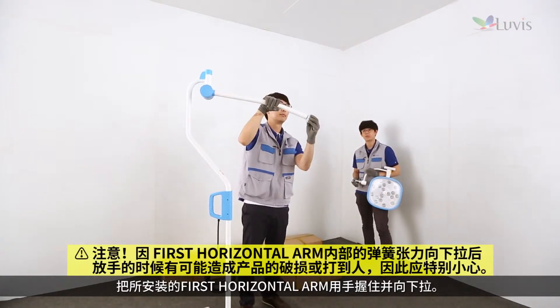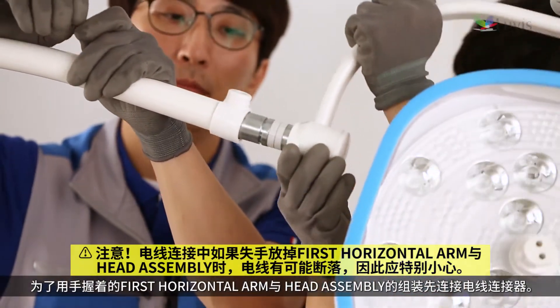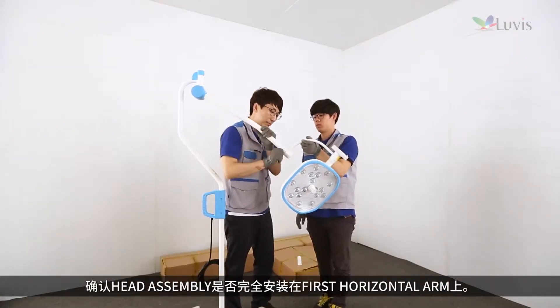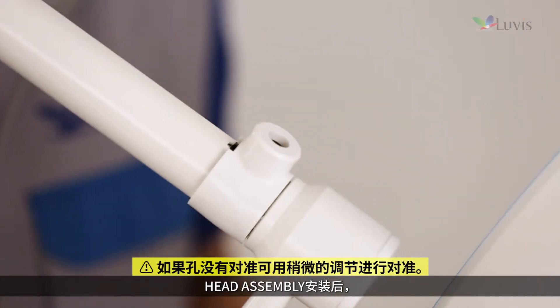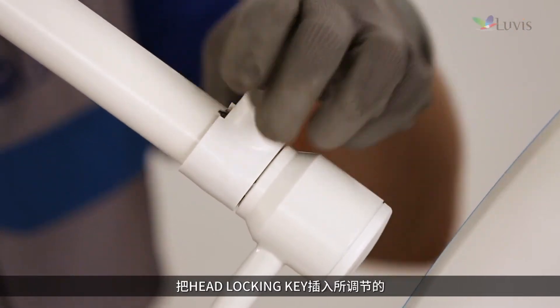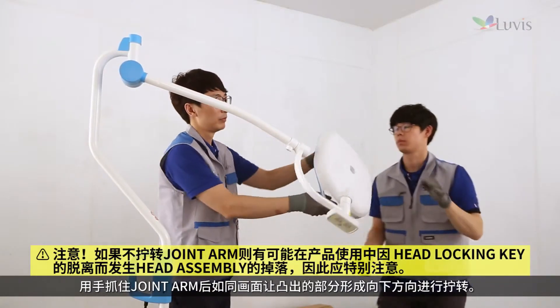Open the head assembly box and check the status. Hold the installed first horizontal arm and lower it down. Tighten the wiring connector first to assemble the first horizontal arm and head assembly. Hold the head with the lighting source face-down and insert the head assembly into the first horizontal arm. Check that the joint arm groove and the first horizontal arm's head locking key groove fit perfectly, then fix them by inserting the head locking key into the groove.